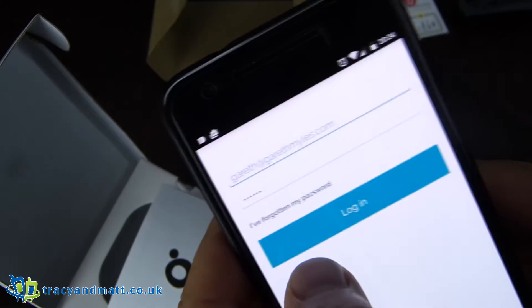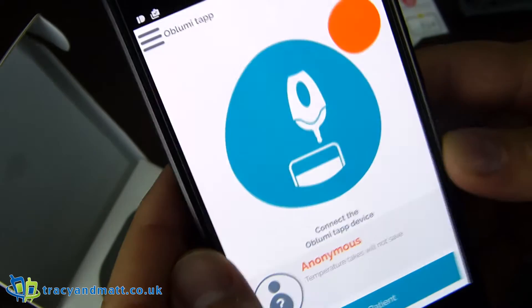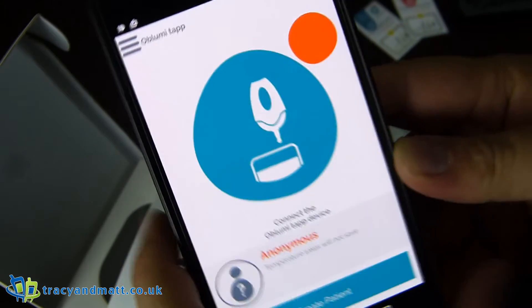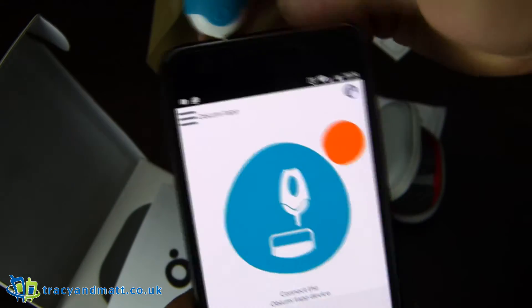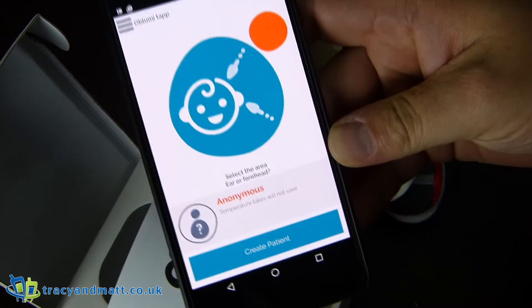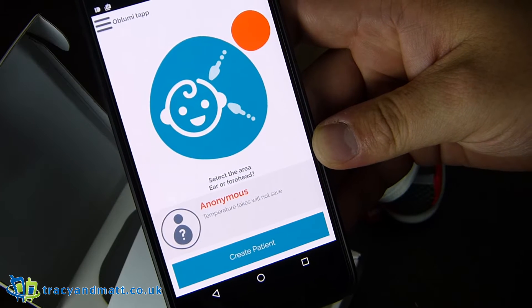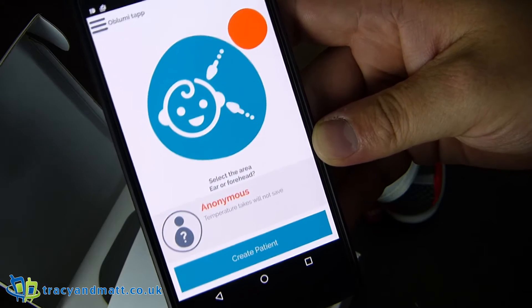We had to wait for the email to come in to activate the account. We can now log in and see the meat and bones of the application. Connect the tap device — detecting device, detecting device. Very simple. Select the area: ear or forehead. That's very good. We're not going to be doing a measurement right now.